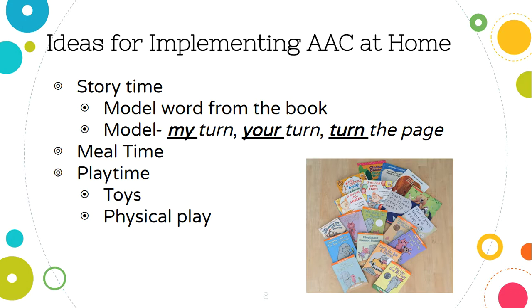Another thing that you could do is model about the book or what you're doing. So it's my turn to turn the page, or my children used to like to read those lift-the-flap books when they were younger, and they would take turns. So my daughter would lift the flap on the first page, and then my son would take a turn, and then they'd go back and forth. So it could be it's my turn, or it's your turn, or we're going to turn the page. So you can talk about that as well.